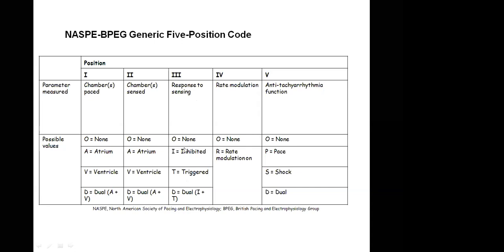Okay? Sorry, sir. Can I ask a question? Yes, sure. Thank you, sir, for the response. How do you regulate it? At what time do you need to trigger the process of activating the pacing?